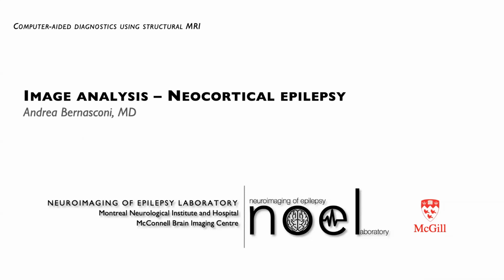Hello. In this lecture, I will discuss image analysis techniques applied to neocortical epilepsy, focusing on cortical dysplasia. First, I will present a method to assist the visual detection that you will be using during the course and demonstrate its utility to transform MRI negative FCD to MRI positive FCD. In the second part of my talk, I will show you data on recent methods we have developed for a fully automated detection and biotyping of focal cortical dysplasia.